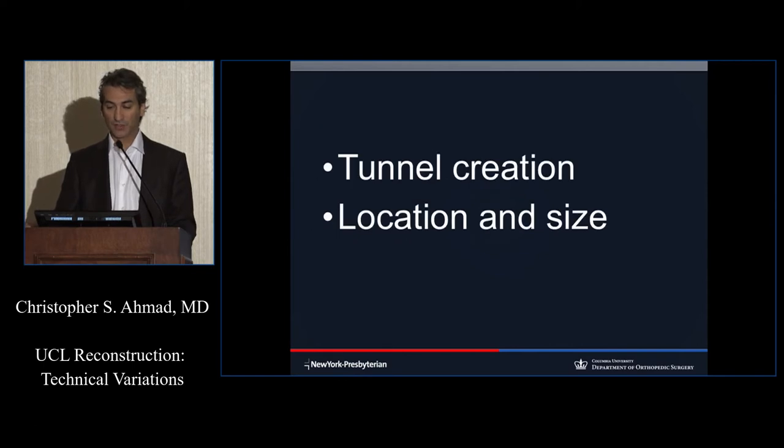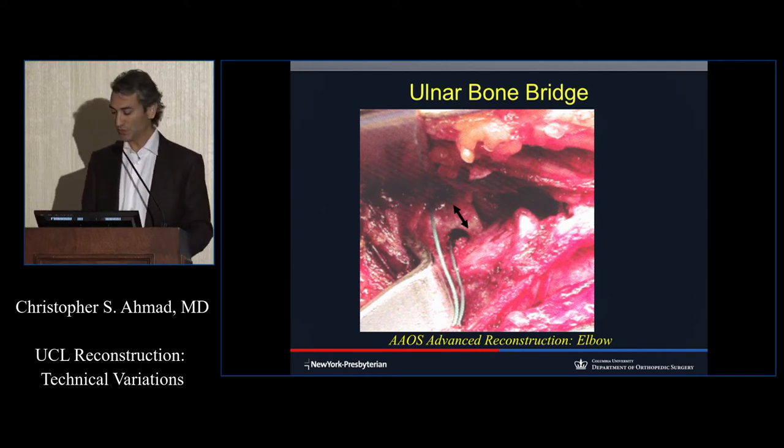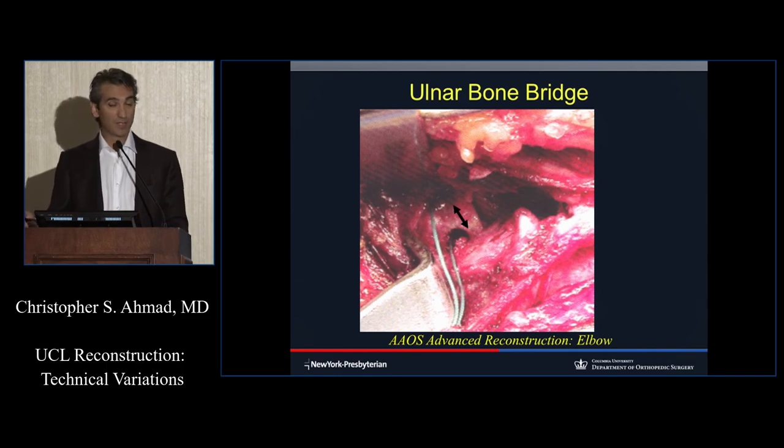Okay, here's tunnel creation, location, and size. This is something that is the technical part. This is the surgical part. This is from a book that many people have on their shelf. It is an instruction on how to do surgery, and it describes how to do ulnar collateral ligament reconstruction. And I look at this and I see their ulnar bone bridge. This is an example of how to do it. Those holes that you see there are described as 4 millimeters. This is a 4 millimeter hole. This is a 4 millimeter hole. This bone bridge, I estimate, is probably about 4 millimeters.